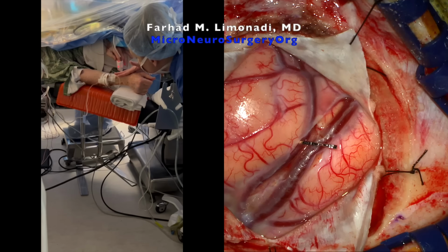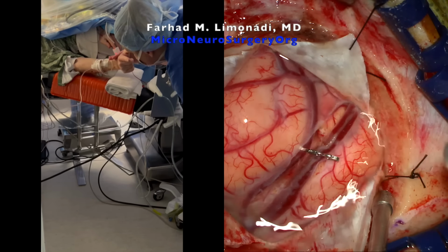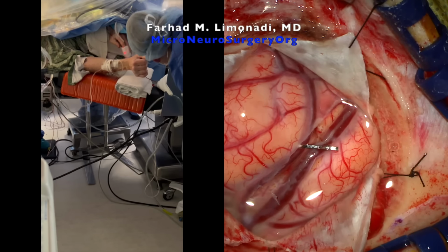Try to lift, push up against me here with this hand. Push up against me like that. Yeah. There you go. You're moving everything. Everything's good? Moving arms and legs? Yeah. Beautiful.